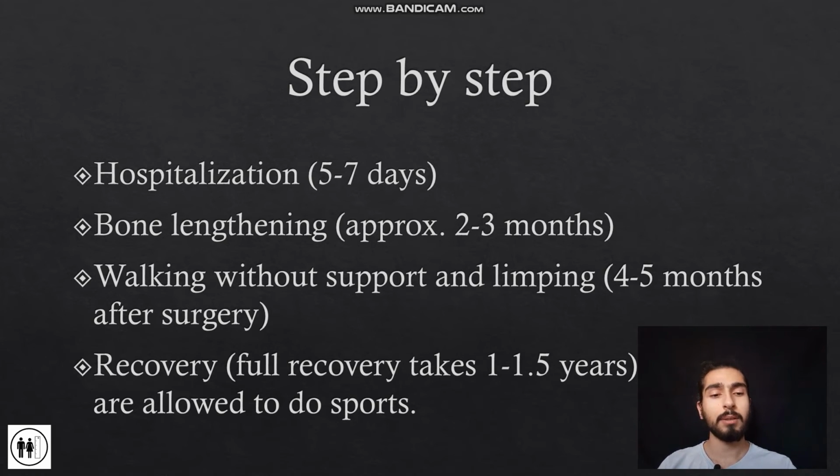I should note that the nails are designed in a way that they are suitable to remain inside the bone without causing health problems or corrosion, and they don't beep at security checks and metal detectors. With the development of the Stryde nail, patients may walk throughout the whole procedure as long as they don't have any pain and they can tolerate it.